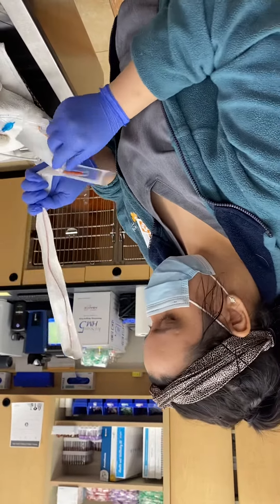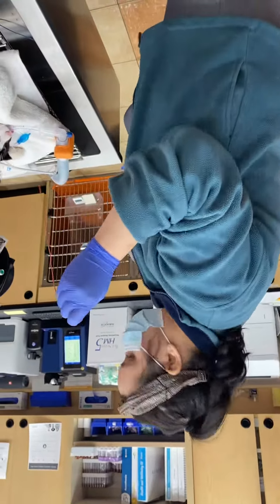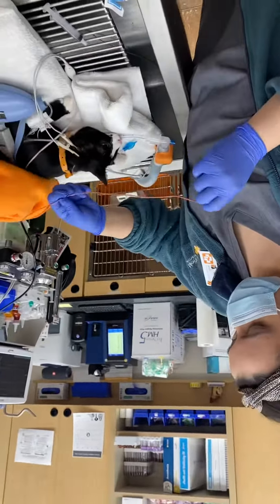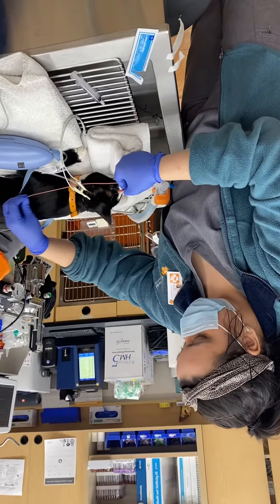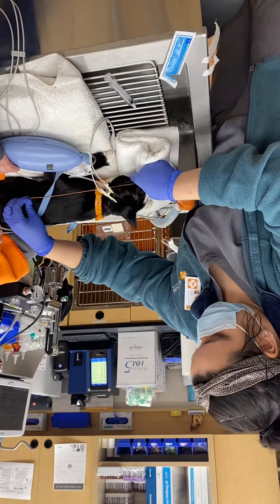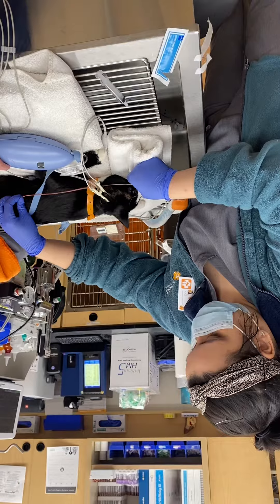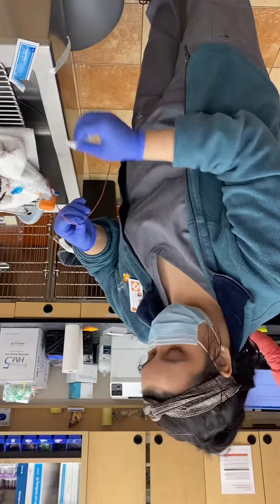I will be starting by measuring to make sure this is adequate size. I'm taping it right there, and I'm using my tape as a marker.